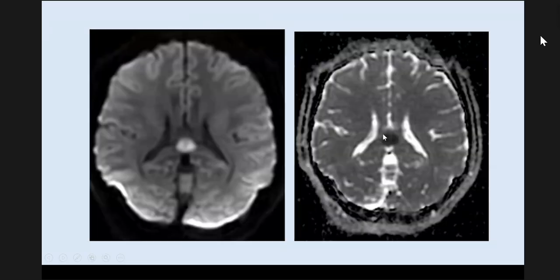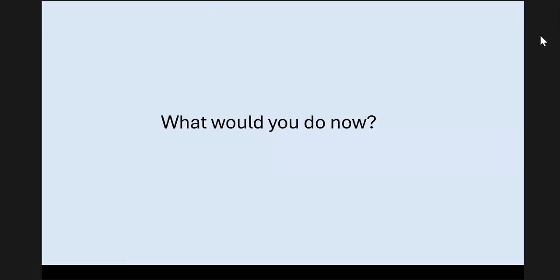And it also showed marked avid diffusion restriction. So at this stage, what would you want to do? So the surgeons were keen to take it out. I think somebody has already given the answer. Yeah. Let me just move on to the next slide.